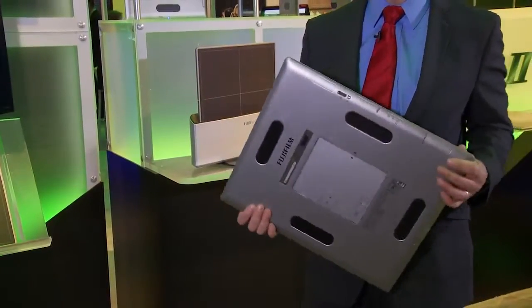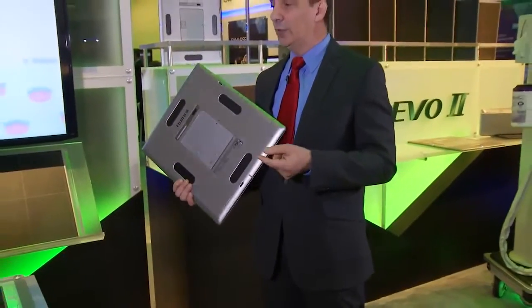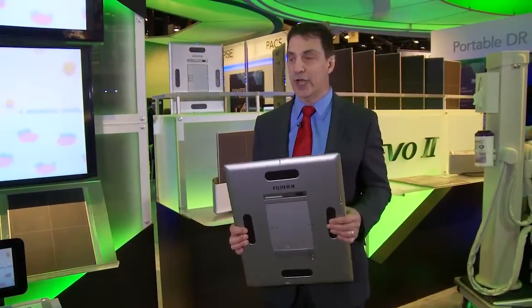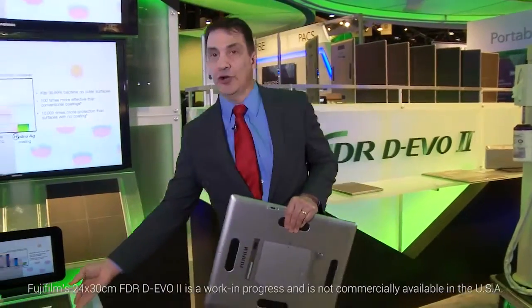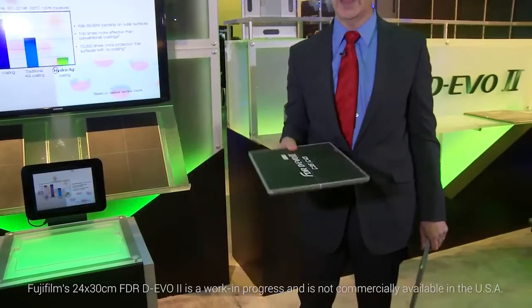There are a lot of advancements in the detector. The detectors are available in all sizes, including the 14 by 17 traditional standard size and the 24 by 30, which is very unique to Fuji.